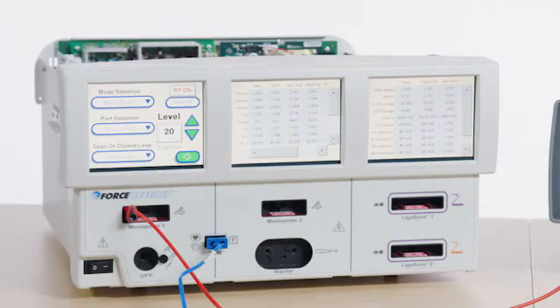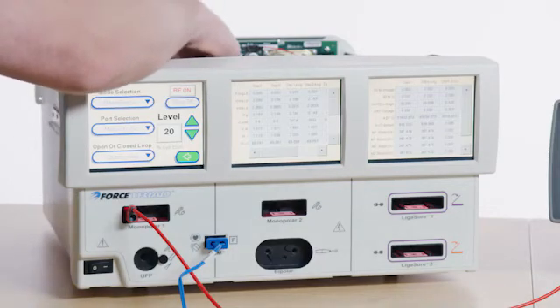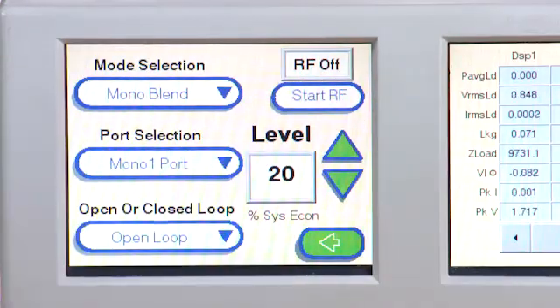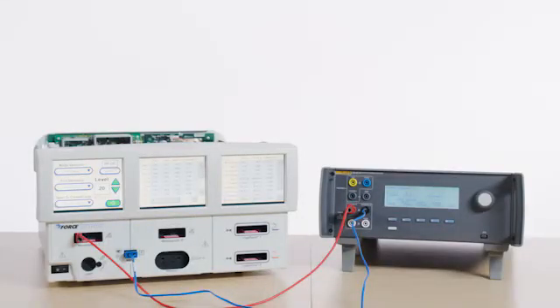Adjust the inductor potentiometer located on the HVDC PCBA to get the lowest possible reading on the QAES-3. Select Stop RF when the optimal current value has been reached, then turn the system off.